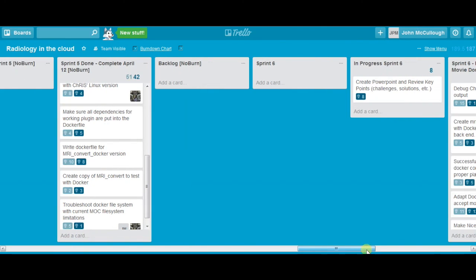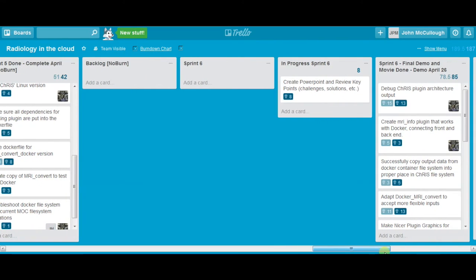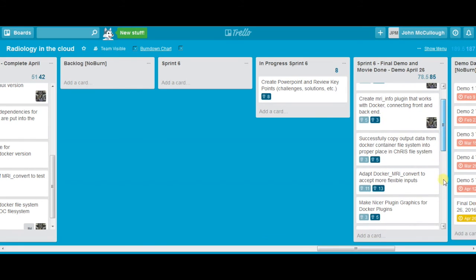Once we figured this out, it was simple to copy the output correctly and Dockerize a few more plugins and stress test each. We also changed some of the plugin graphics to illustrate that they use Docker, and spent a significant amount of time creating this final video.